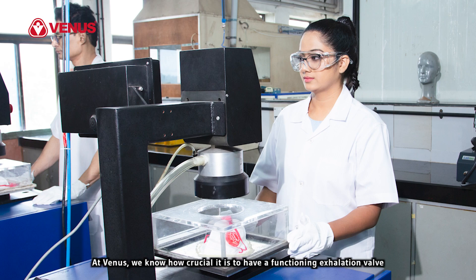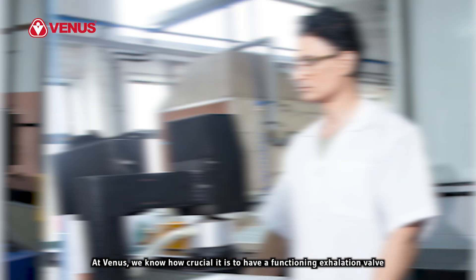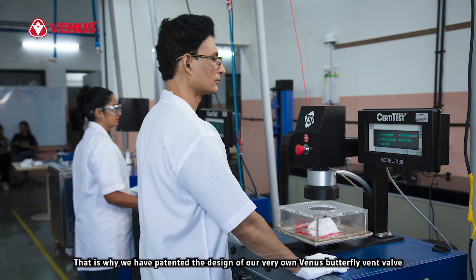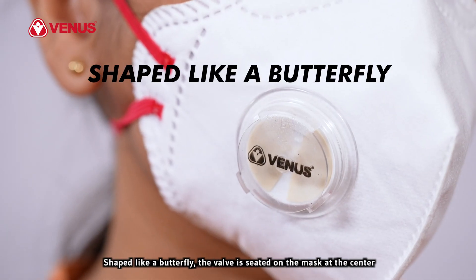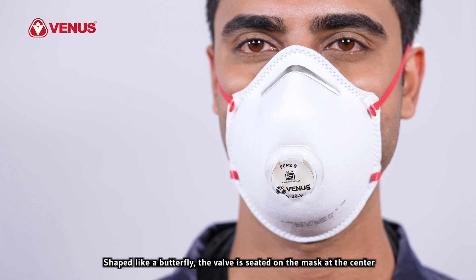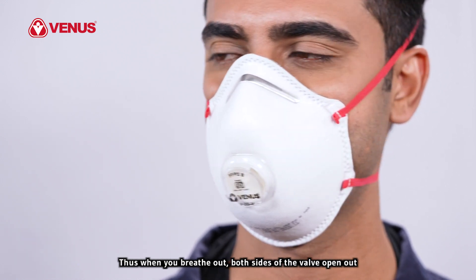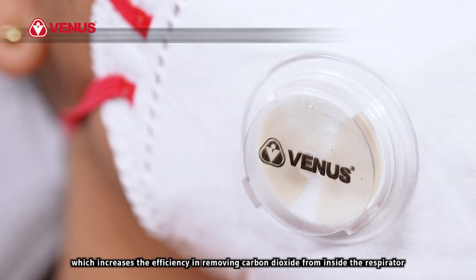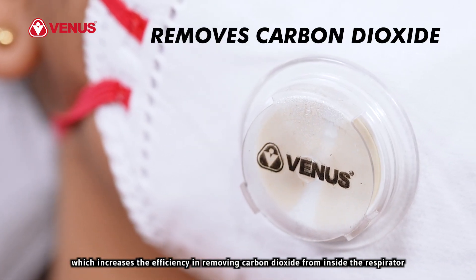At Venus, we know how crucial it is to have a functioning exhalation valve. That is why we have patented the design of our very own Venus butterfly vent valve. Shaped like a butterfly, the valve is seated on the mask at the center. Thus, when you breathe out, both sides of the valve open out, which increases the efficiency in removing carbon dioxide from inside the respirator.